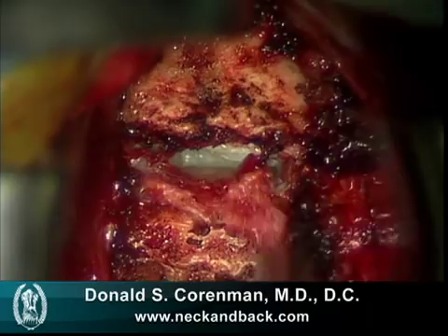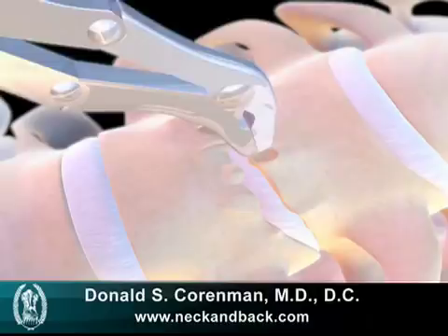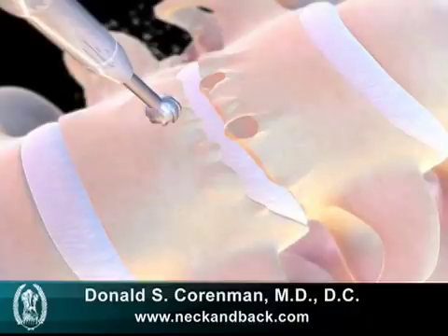We then remove the spurs on the front portion of the neck so we can get the two vertebra parallel and have a good spot to dock our plate. In addition, it allows us to know the depth of the graft that we need. Here we see a burr taking off these spurs.